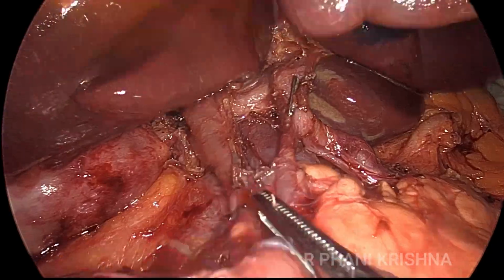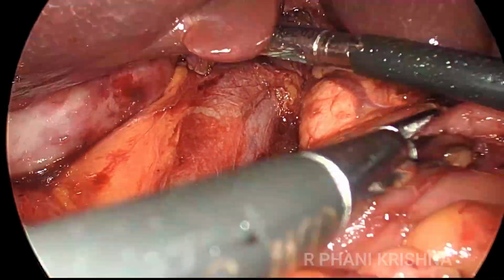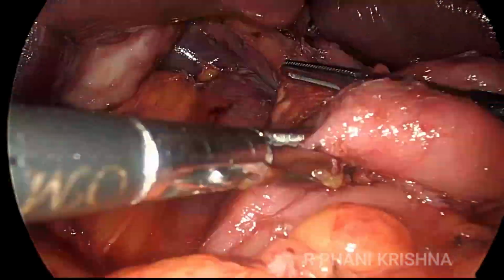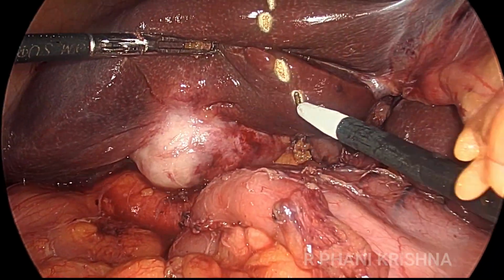until the liver hilum. You can see the proper hepatic dividing into the right and left. Again, special attention is paid to the pancreatic capsule there. Sometimes you can have troublesome bleeding there. Just make sure that there is no bleeding. Once that is done, we proceed with the liver resection.